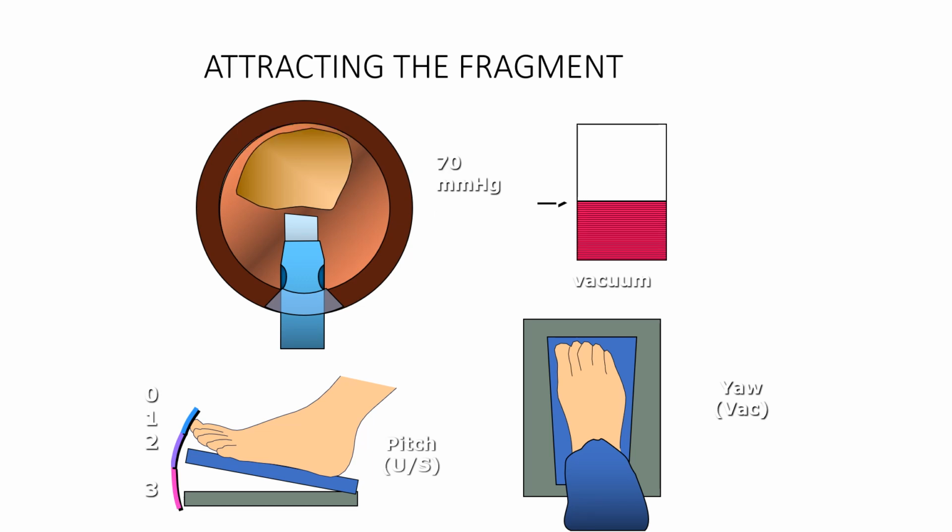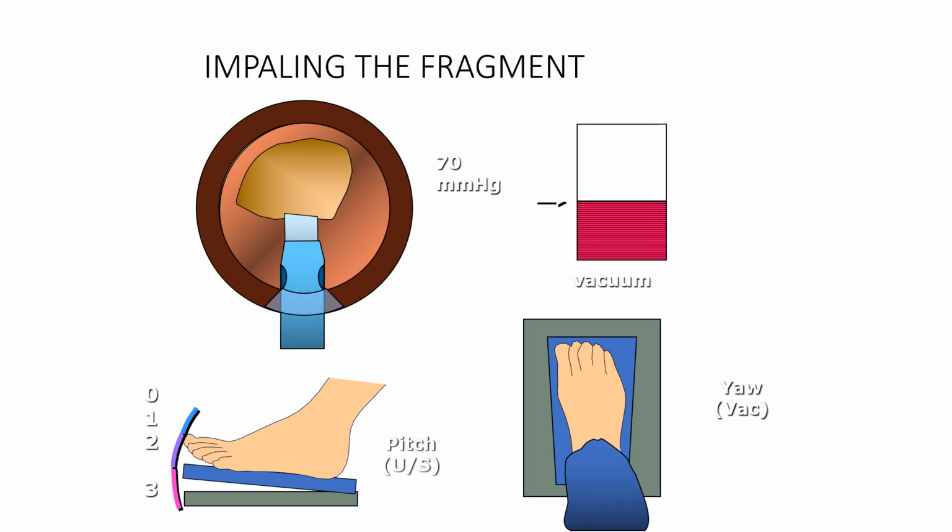As the surgeon goes into foot switch position 2, the pump of the peristaltic machine starts rolling and drawing fluid from the eye. With how much speed the pump starts to rotate will depend on the preset. So now that the vacuum has reached its preset levels and you have got a good grip on the nucleus piece that has occluded or blocked the phaco tip, this is the time to go to foot switch position 3 and add power to break the nucleus.